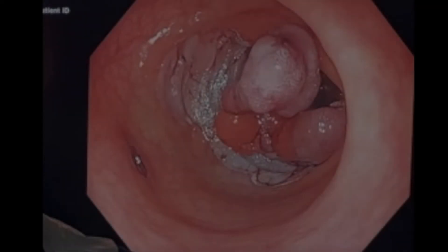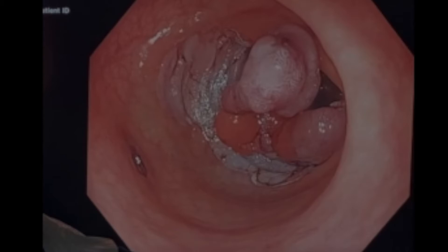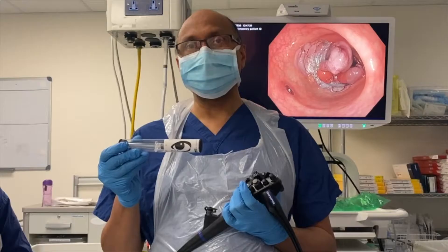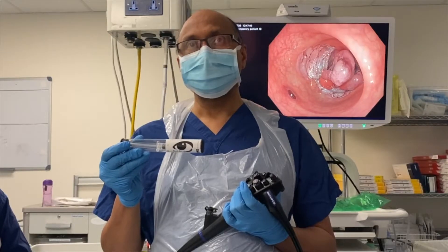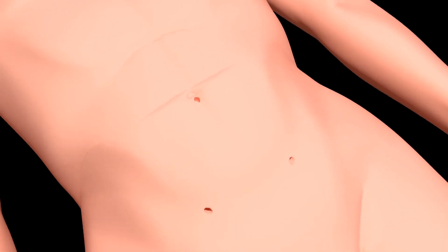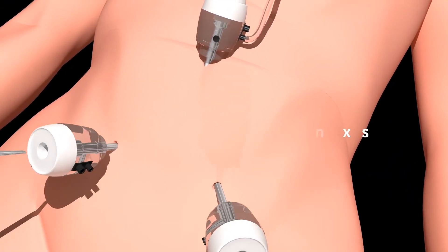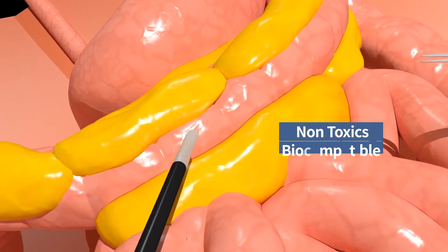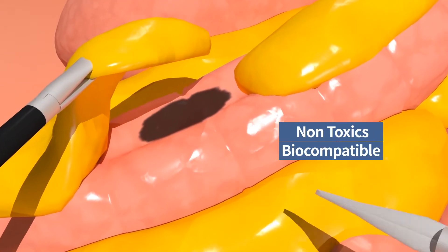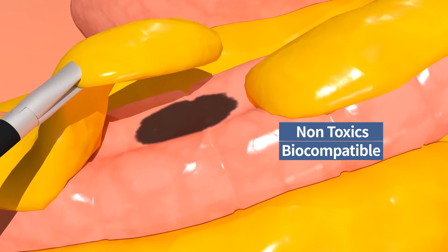We have a difficult situation here. We now encounter a significant invasion, so we are going to put a tattoo. That will form a marker for our colleagues when they go in to remove this and block it in a radical fashion. I will show the technique of how we place a tattoo.